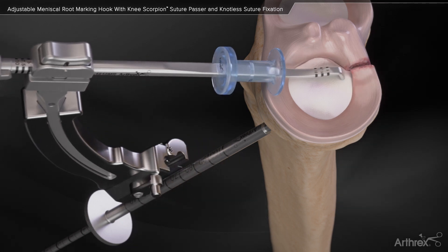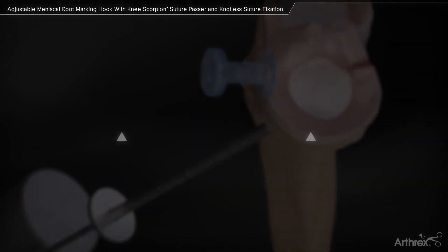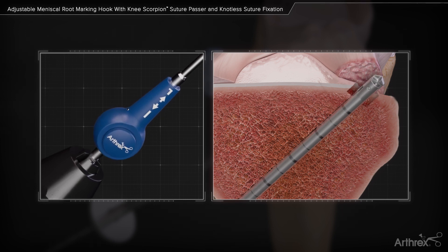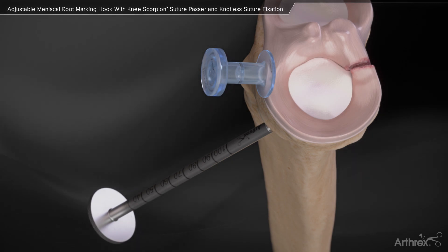Remove the drill guide, maintaining the drill sleeve on the tibia. Engage the cutting tip. Use the flip cutter to decorticate the bone in the area of root attachment. Slowly advance the flip cutter back into the joint and straighten the cutting tip.